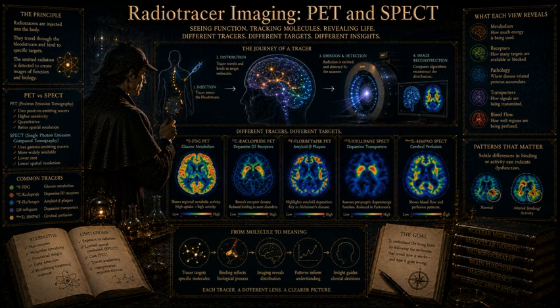That is a brilliant way to conceptualize the shift in perspective. We are no longer looking at the streets. We are explicitly tracking the cargo. We are tracking specific biologic processes in vivo. We are isolating neurotransmitter systems, quantifying receptor availability, and measuring cellular metabolism as it actually happens. Okay, let's unpack this, because before we can talk about how this illuminates schizophrenia or depression or target engagement for new medications, we have to deal with the sheer mechanical physics of it all.